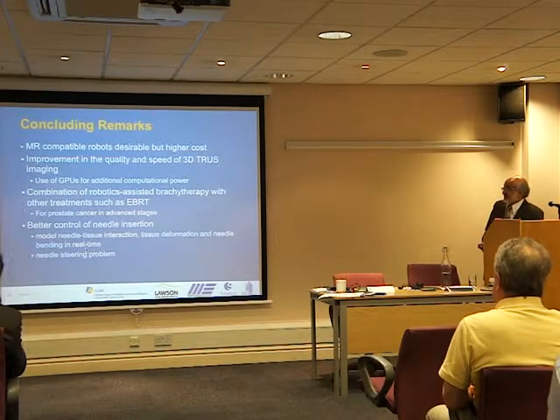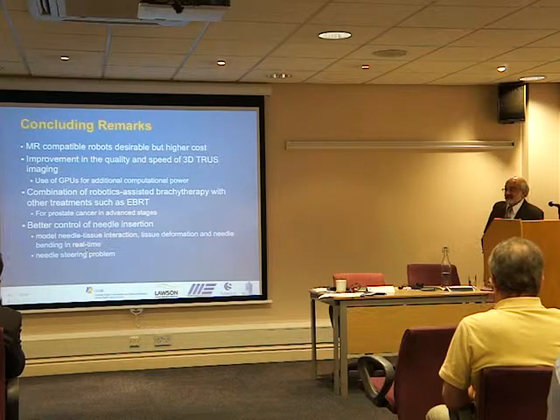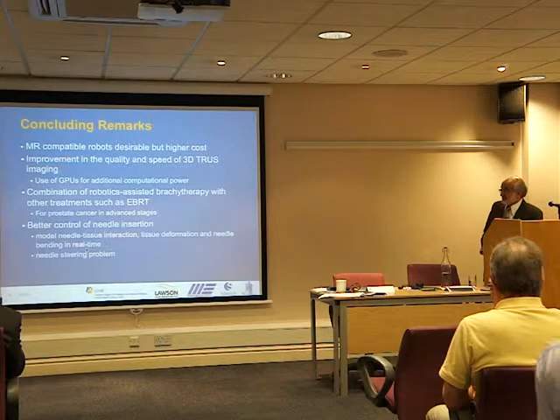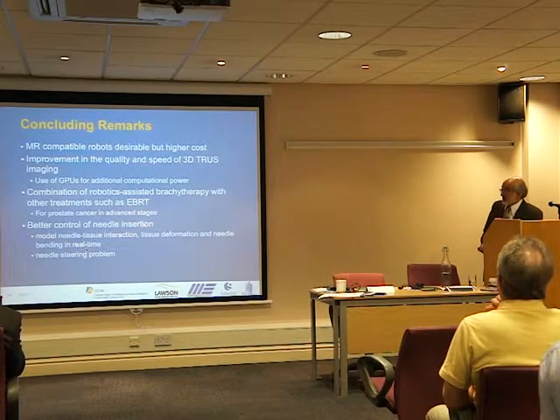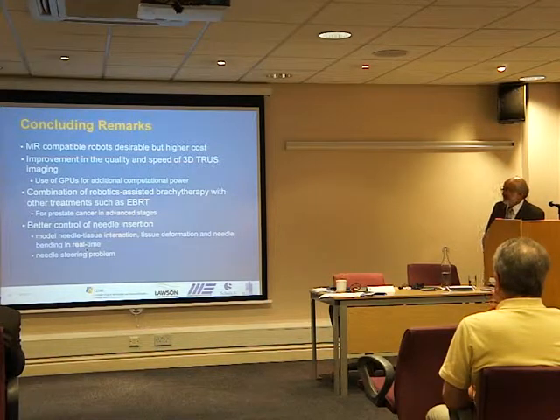Now, I mentioned that in more advanced stages of cancer, it's possible to use brachytherapy with other methods. There has been work reported on external beam radiation therapy with brachy, but there may be other approaches as well that one could use. We can expect more accurate needle insertion once some of these problems with tissue modeling, tissue deformation, etc. are addressed.